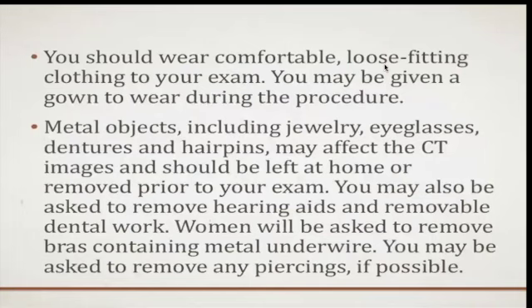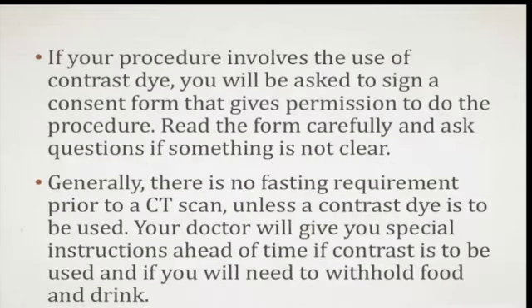If a patient is coming for a CT, now this is just basic stuff, they should wear comfortable, loose-fitting clothes, and maybe we would give them a gown. Metal objects, including jewelry, eyeglasses, dentures, and hairpins, all of that may affect the CT. So we ask patients to remove any metal objects before taking a CT image. And again, if we're using a contrast dye, because contrast may cause allergies, as we said, even though it's just in a handful of patients, or it may cause a lot of trouble for a patient who has any kidney problems.